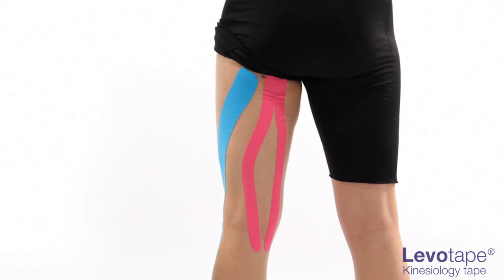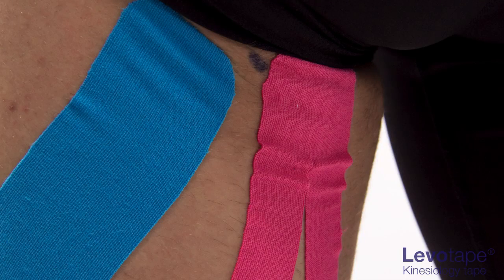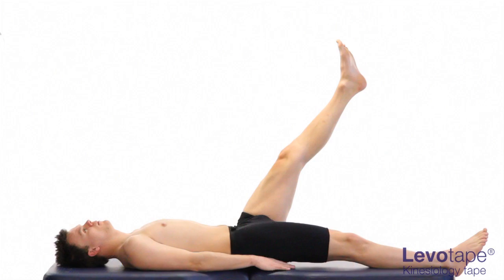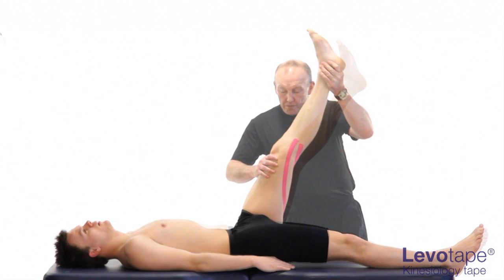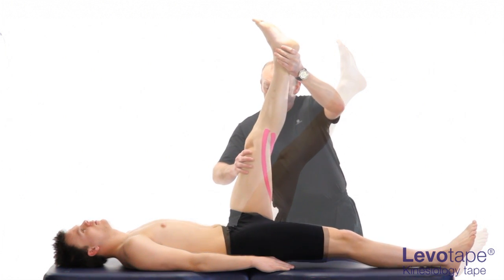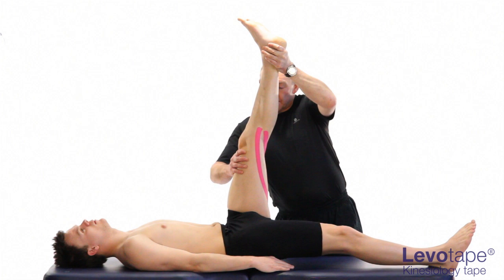Convolutions may be visible, but this is not a crucial indicator. Upon retesting the SLR, an immediate increase in hip flexion should be experienced. The therapist should report, and the patient experience, a freer and lighter movement of the leg.